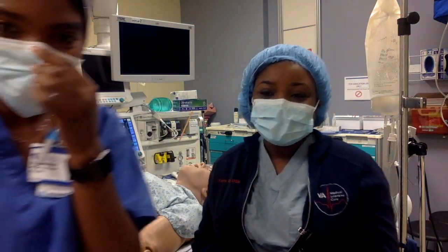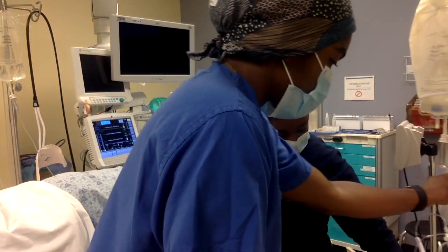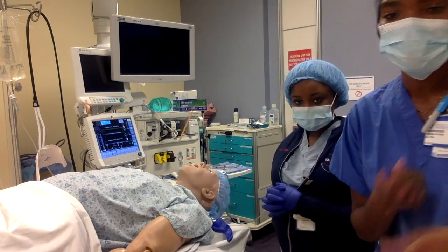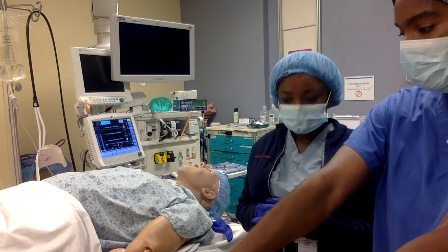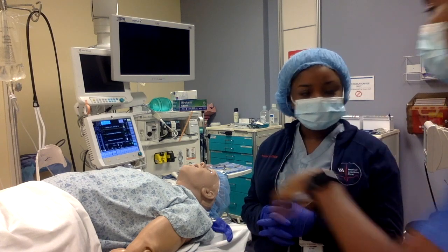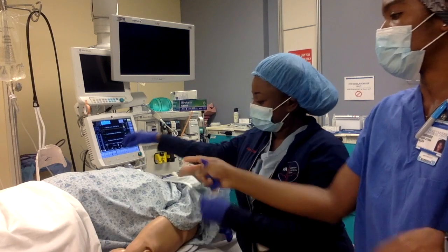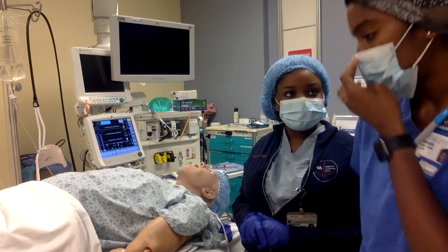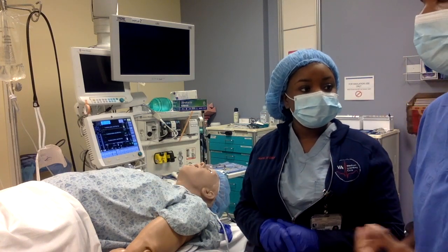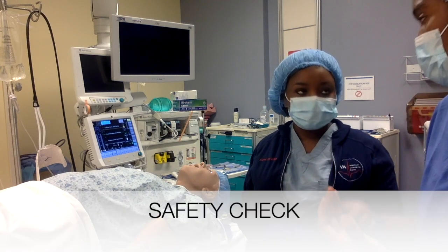Alright, let's get this started. So you've rolled your patient in. One major key: untie, untie, untie - make sure you untie as you're moving over to the bed. You want to check: do you have any ties underneath, any undergarments? A lot of places will also have the patient state who they are, then review and do another safety check on allergies.